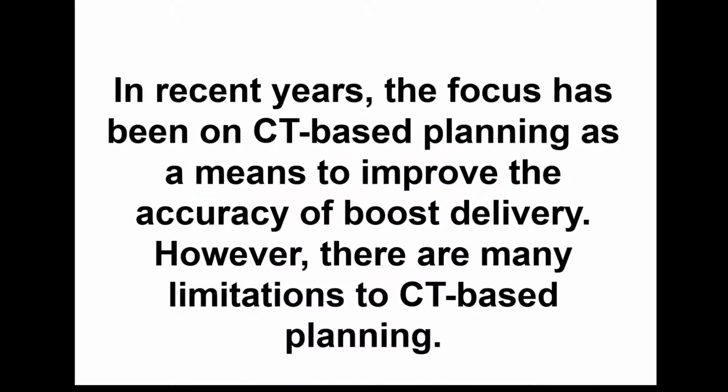And then coming back to how we plan, what is the image guidance platform from which we plan boost? We look at CT scan primarily, but if you ask a breast imaging specialist what is the worst way to look at the breast, they'll tell you with CT. It's a very inexact way to define a target tissue in the breast. Next slide.